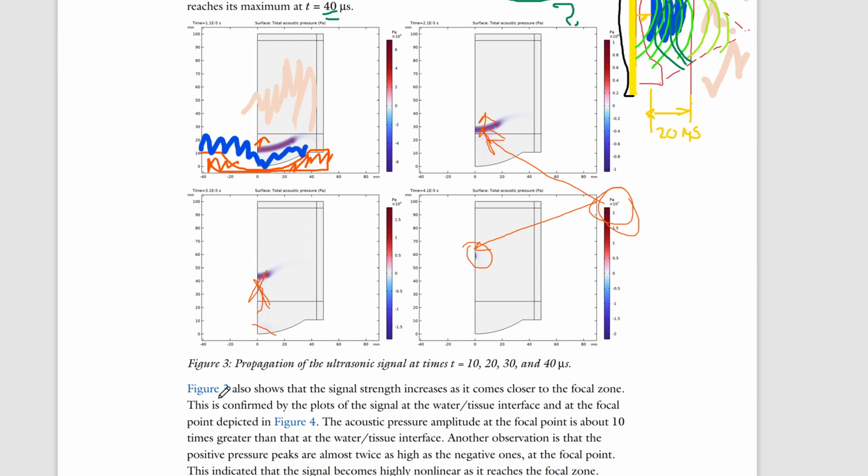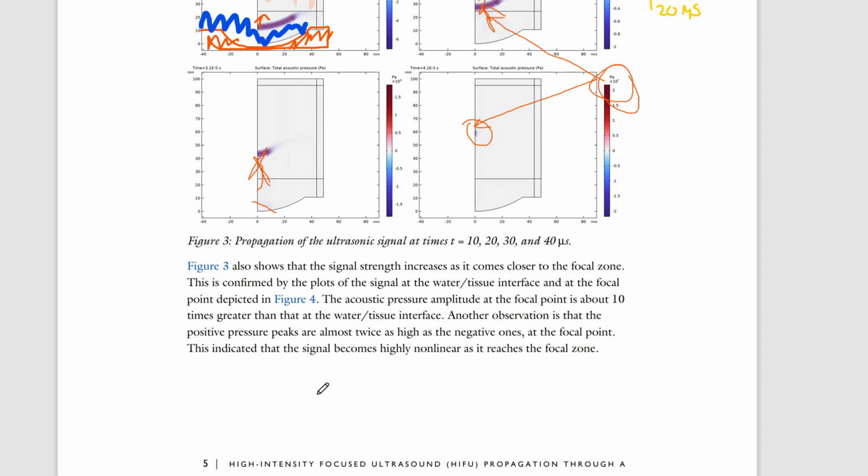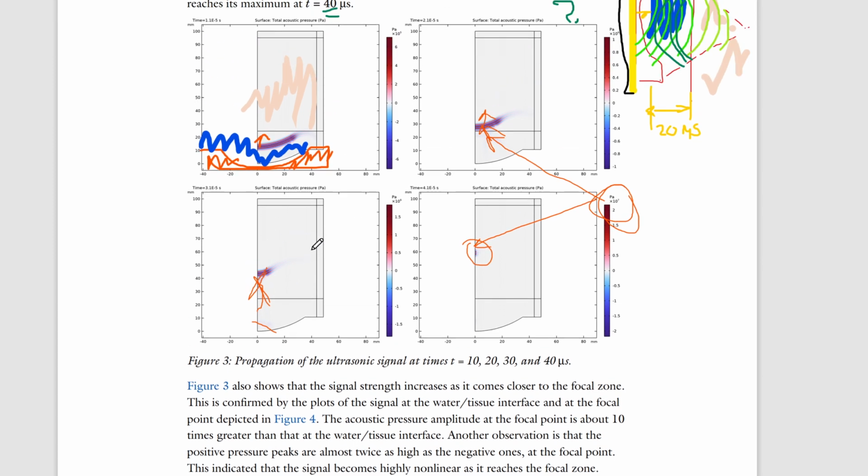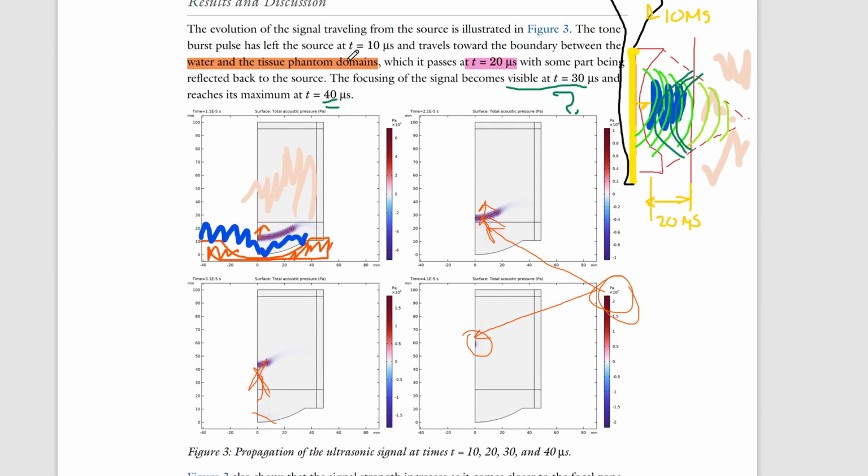So next, figure 3 also shows... Okay, we're also seeing the signal strength increase as it comes closer to the focal zone. And that's the part that's confusing. I'm not seeing this, but you know what? Let's see, actually, hold on.